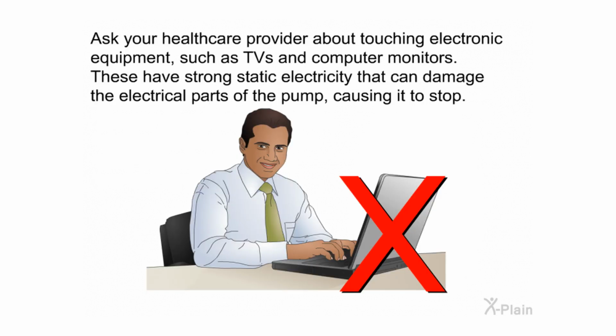Ask your healthcare provider about touching electronic equipment, such as TVs and computer monitors. These have strong static electricity that can damage the electrical parts of the pump, causing it to stop.